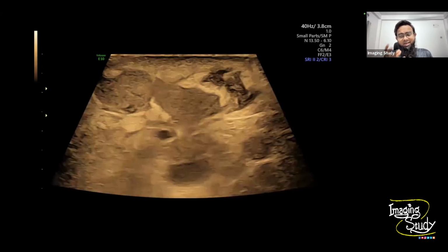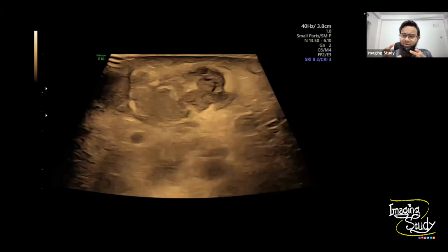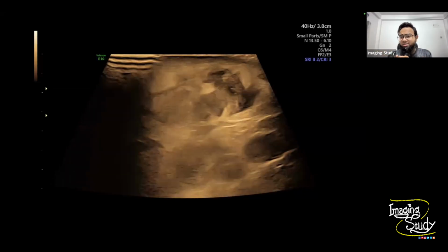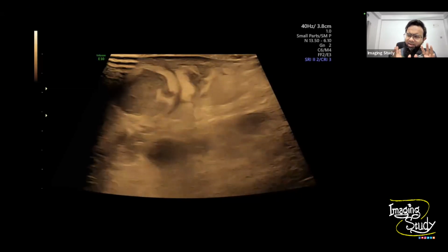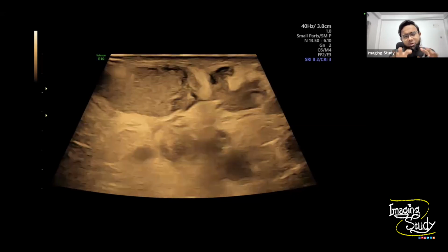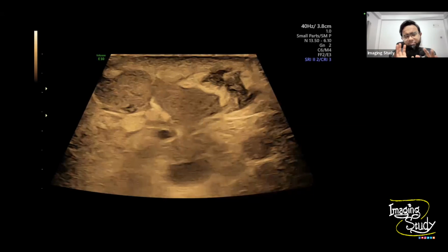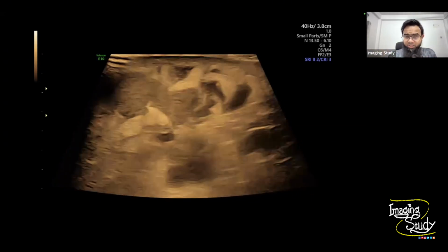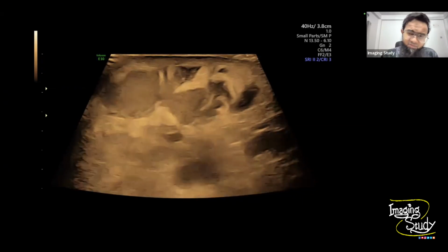So whenever you see an abscess at the location of typical lymph nodes, you should think about the lymphatic origin. Usually the lymphatic origin abscess has an oval shape or a shape like a lymph node. And in the early stage, they're actually a localized abscess. So it's located at the inguinal region over the inguinal canal area. So this is quite commonly of lymphatic origin. So lymph node origin. So this is an abscess which originated from an inflamed lymph node.